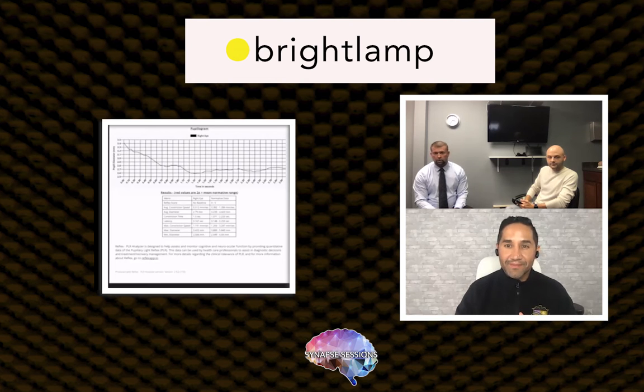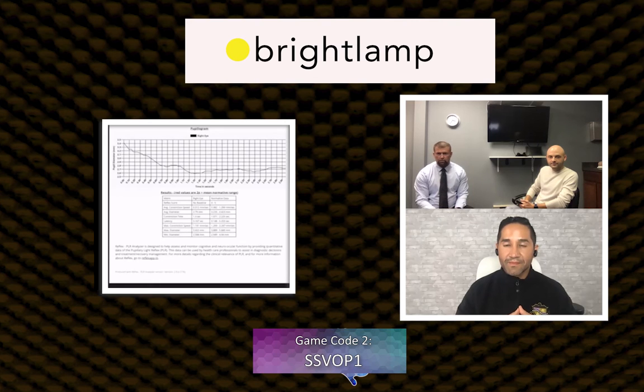It fits really easy. I do my exam, and then my techs, as they're doing the diagnostic tests such as CAPS or Right Eye or VNG, go ahead and do the reflex test, and they print out this PDF and put it in the chart. So I have all that data when I go back in and see it. That's the way I do it. That makes a lot of sense.